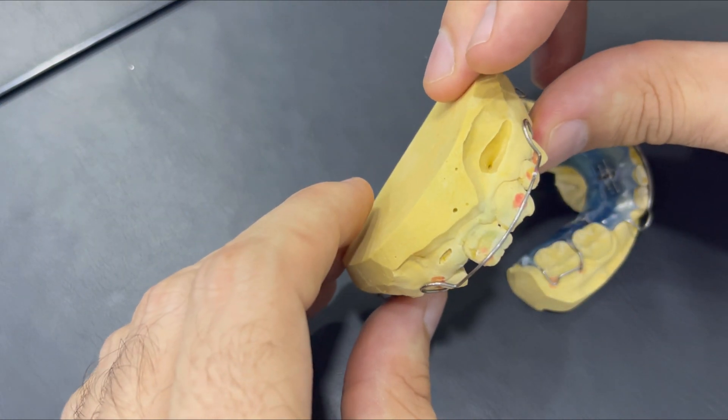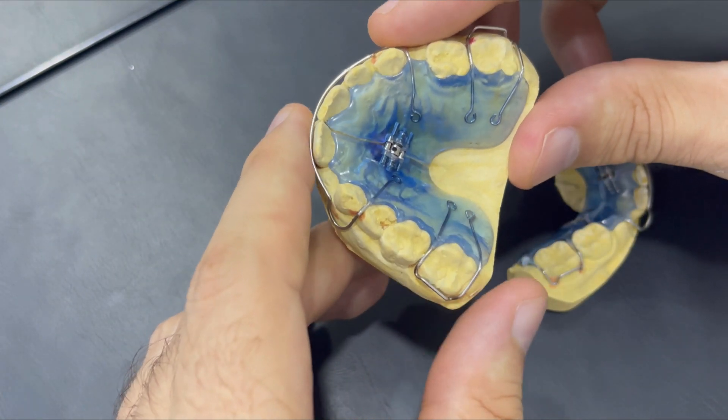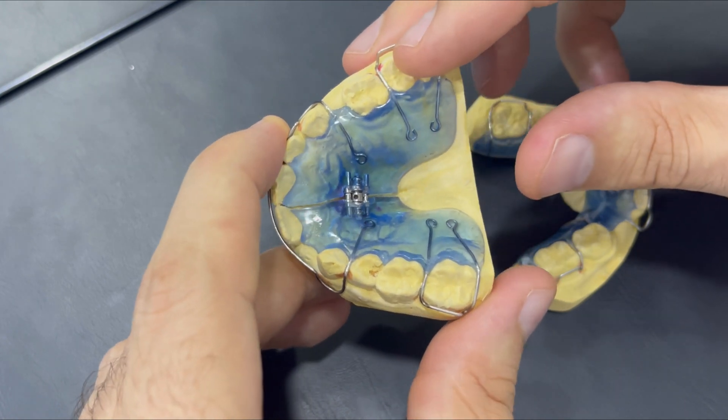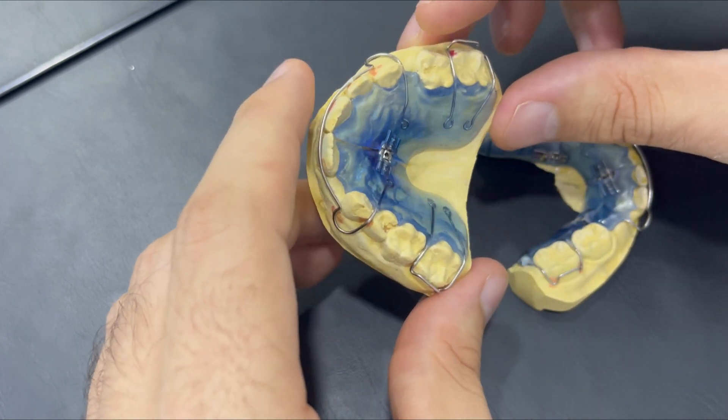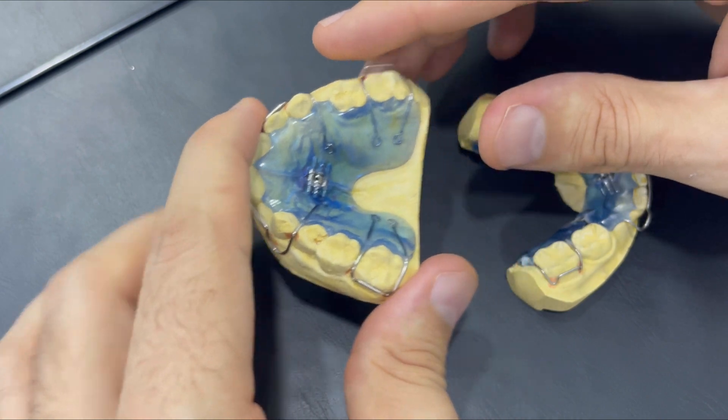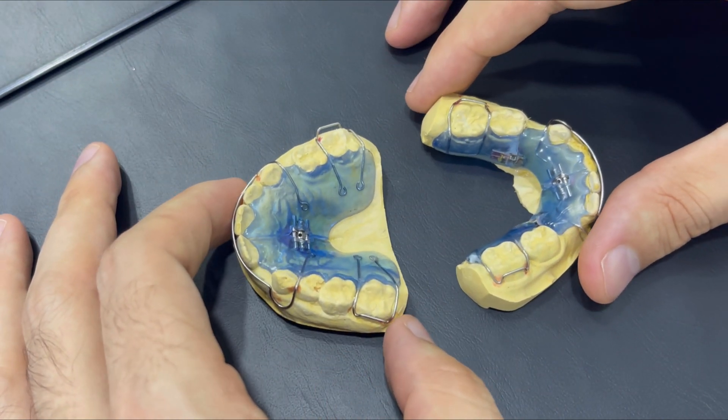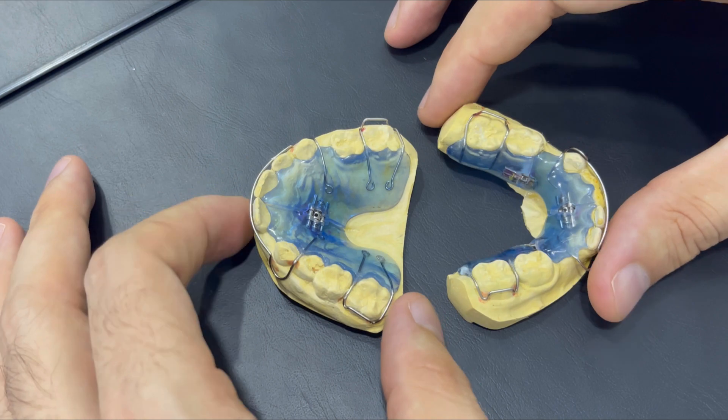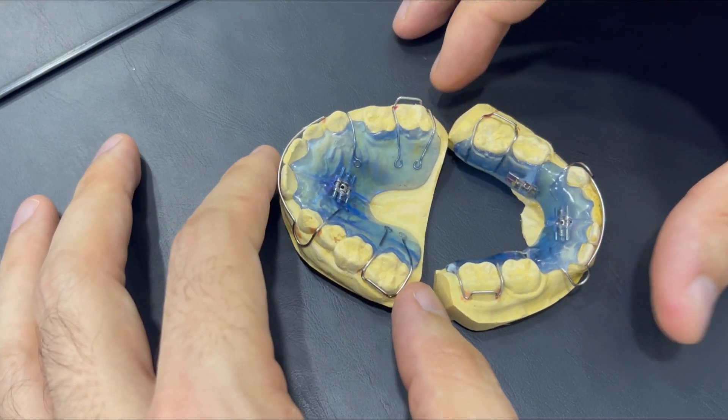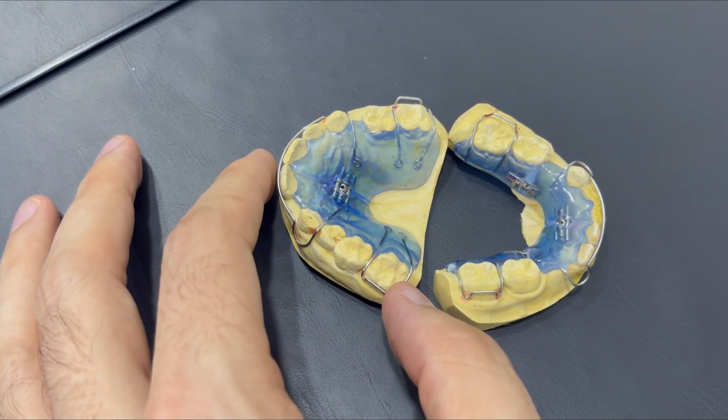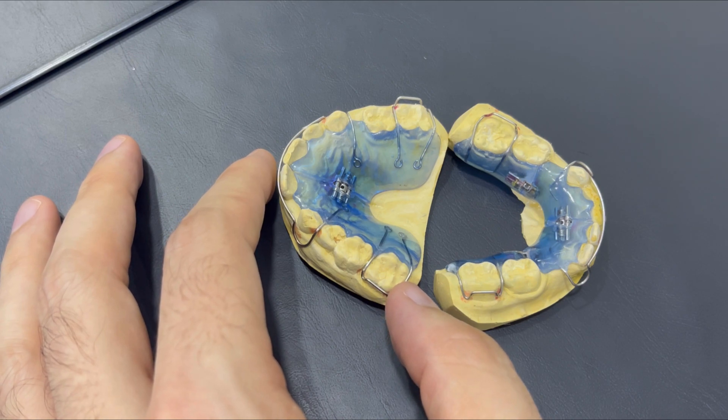The question now is why we need expansion in some cases and some cases we don't do any expansion. The expansion is logically to provide more space for the teeth to accommodate, to align, and to have more space for rotated teeth, tilted teeth, inclined, etc.